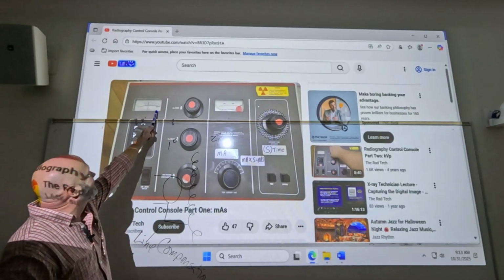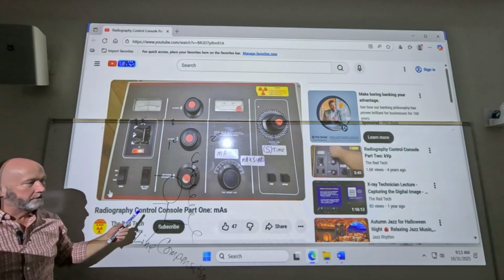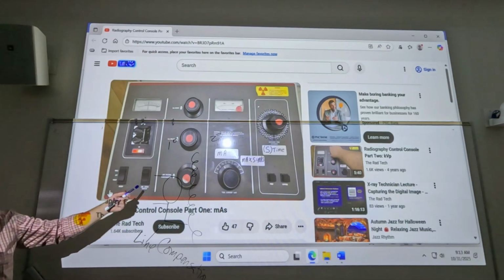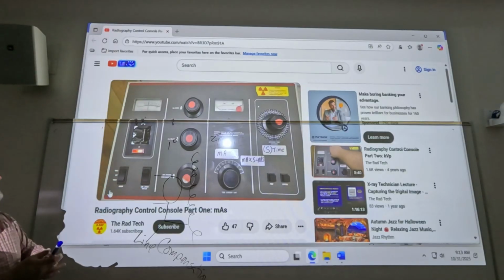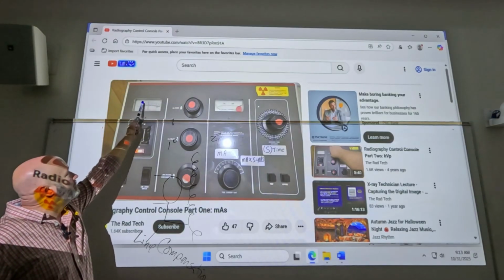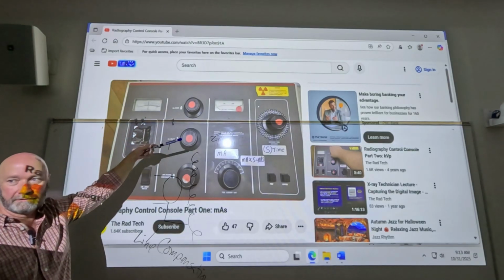Can you see that dark line right there? What you would do is push this button, a toggle switch that's spring loaded, so it flips back to this orientation. When you push that, it's going to move the needle on the voltmeter to where it's showing you how much voltage should be going into your auto transformer.